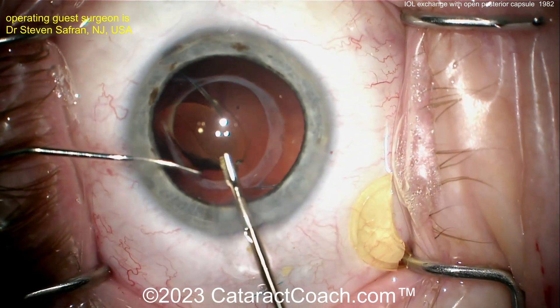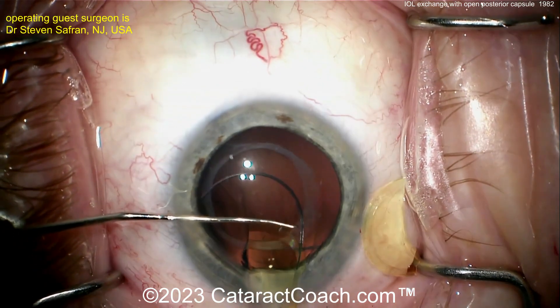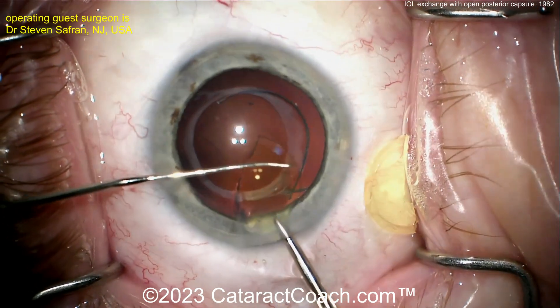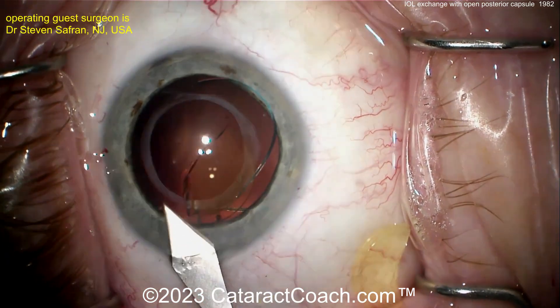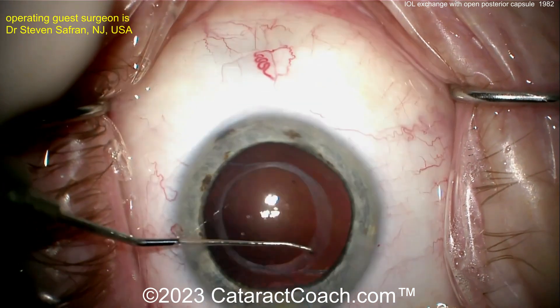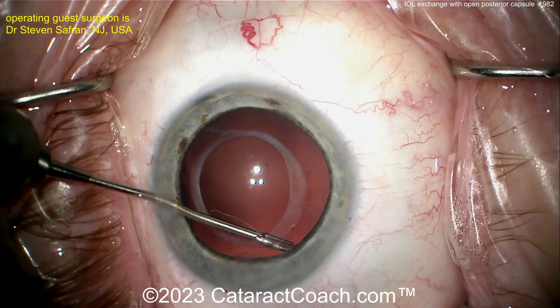This is not what you're used to — normally a lens folds on itself and comes out easily. He tries again to push it out, but it just keeps breaking off little pieces. At this point the incision is enlarged quite a bit just to get that second half out of the eye — grabbing it and pulling it out. Very nice.